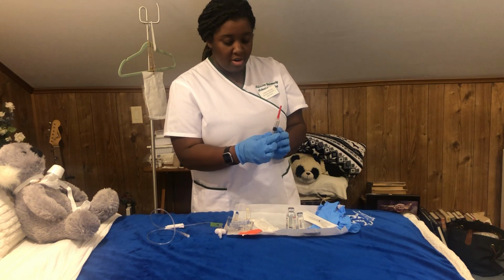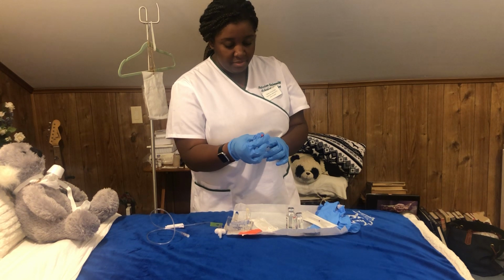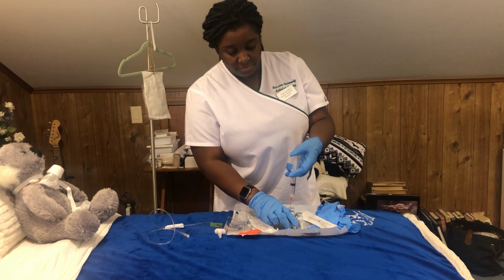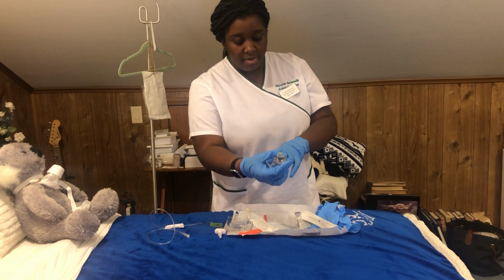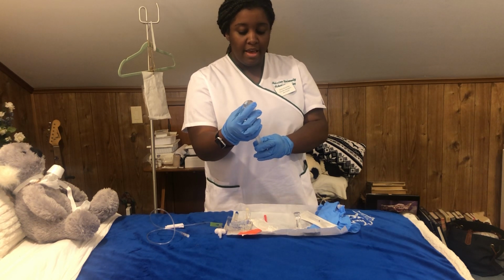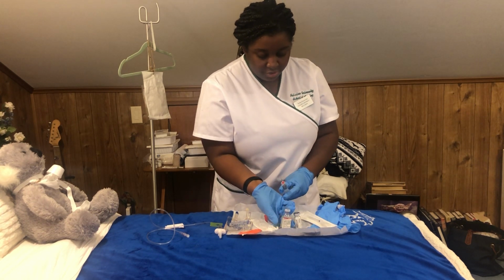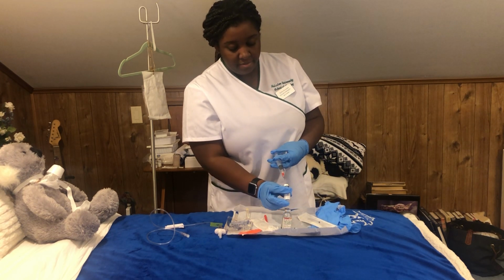Okay, so I've performed aseptic techniques. My air is drawn up to 5.6 ml. I will uncap, put the syringe down into the bottle, and then flip, and then withdraw 5.6 ml of fluid, which I will then pour into my vancomycin vial. Okay.